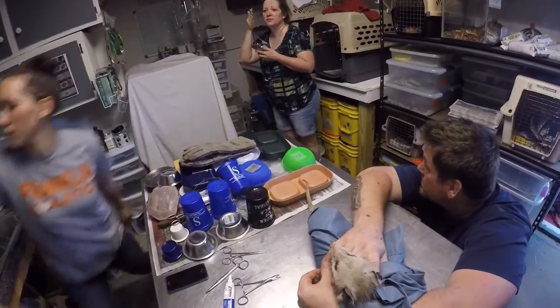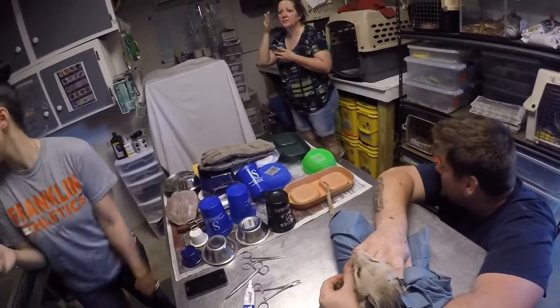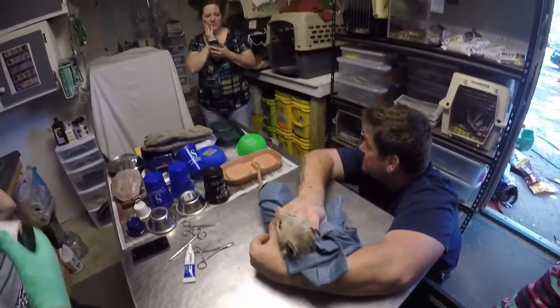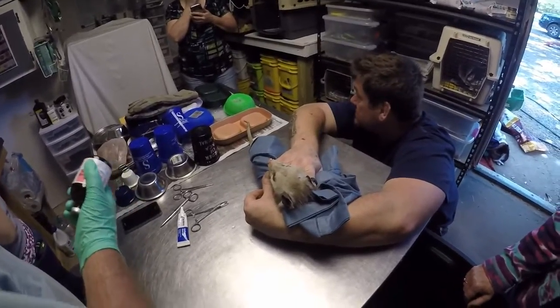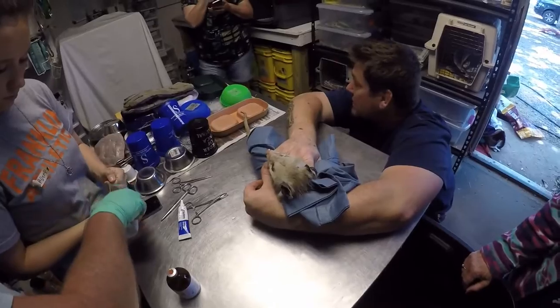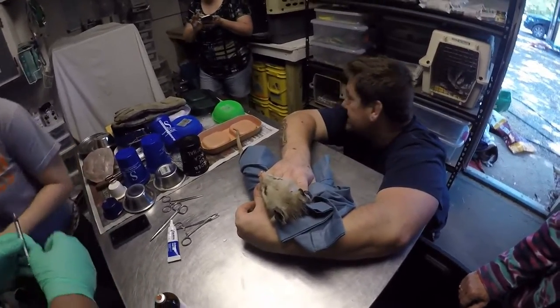I have suture — do you want me to get you a suture? That one we got with one eye didn't make it. He couldn't be released. He's flying in both eyes. I thought he was... We released Cecil with one eye. I can't remember. I was just saying that last one.